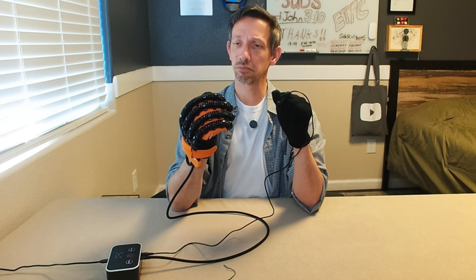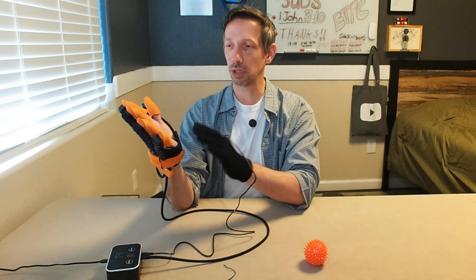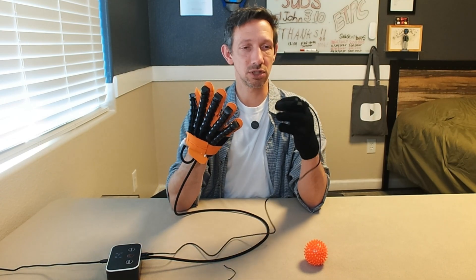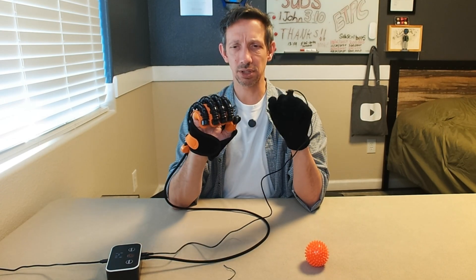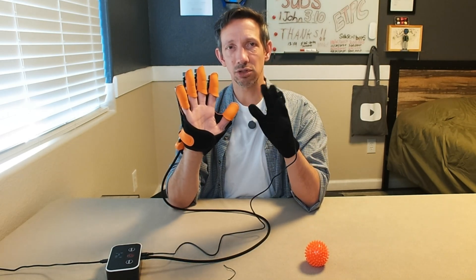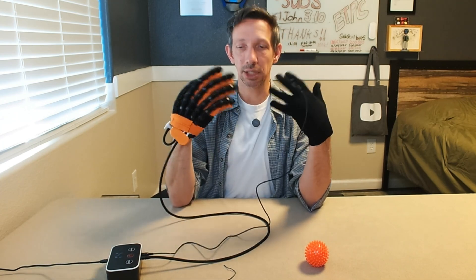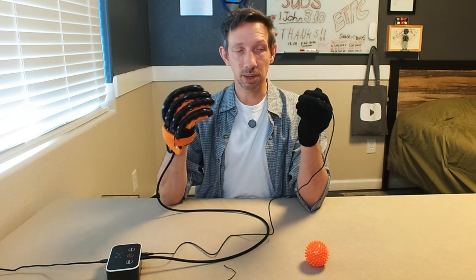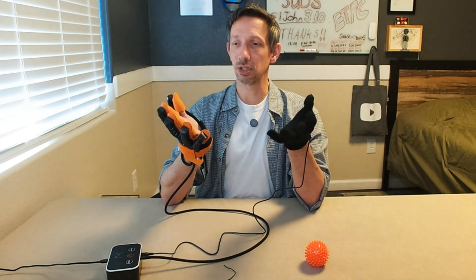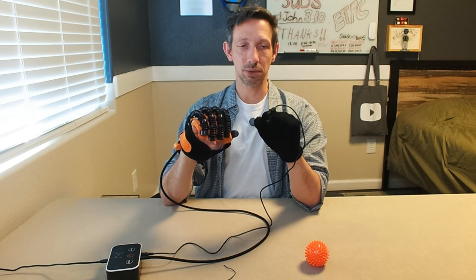Seems to be fairly strong and the stitching quality seems pretty well built, actually. Nice velcro on here. It does come in a bunch of different sizes as well, specifically for stroke patients and things like that — if you've lost function or ability to function in one of your hands. These just help to hopefully get that going again, or maybe you had an injury or some nerve damage — this should help with training your muscles and things to get back to where they were.